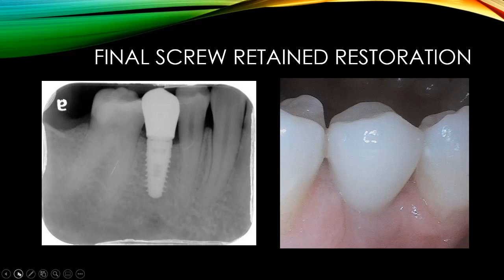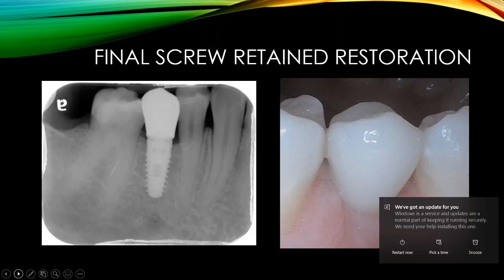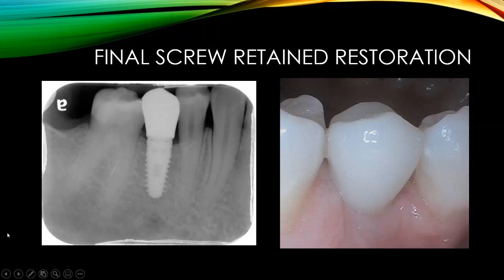It's not that you couldn't do this in office. You certainly could, but it is an investment in hardware and software and in your time. And so some dentists that are very hands-on that would prefer to do it certainly can. It requires having 3Shape Implant Studio software. It would require having a 3Shape scanner. It would require having Implant Direct libraries or your implant company's libraries uploaded to all of that. And it would require a 3D printer and, of course, again, a good deal of your time. And so it is very possible to do in office, but I think for most people, finding a good laboratory to help with it is the most reasonable way to accomplish this.